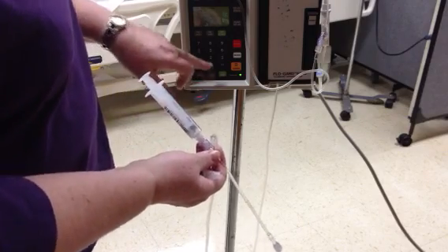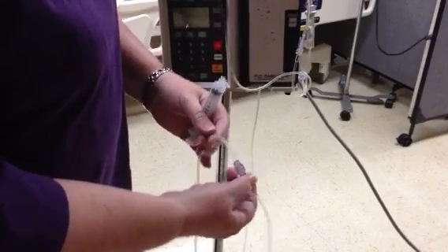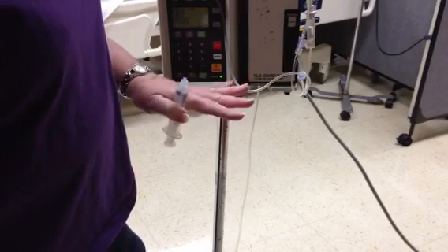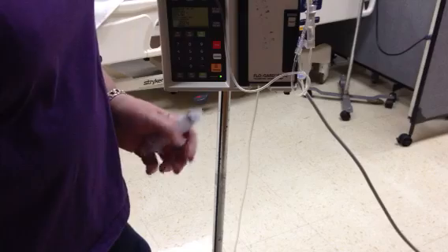Once I'm finished, I turn the pump back on, and I'm done. And that is the case where you have an incompatible medication, and then you treat that pretty much the same as you do a saline lock.